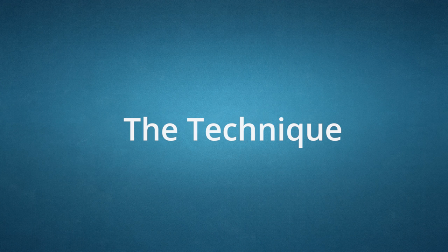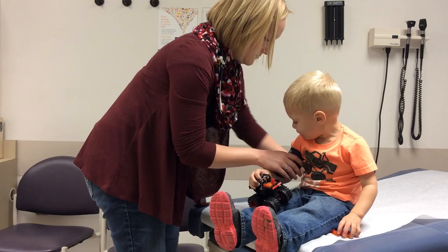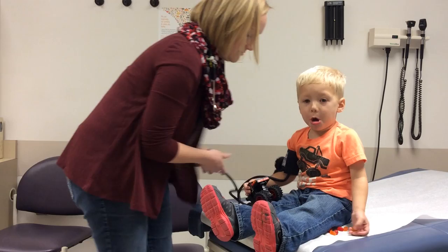For technique, use the stethoscope bell rather than the diaphragm if available. Check measurement on the right arm if only one limb is evaluated. Place the cuff about one inch or two and a half centimeters above the antecubital fossa, paying attention to the artery indicator line on the cuff. Line up the indicator line with the brachial artery.